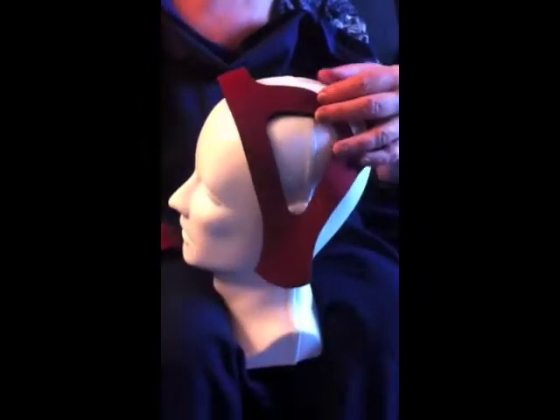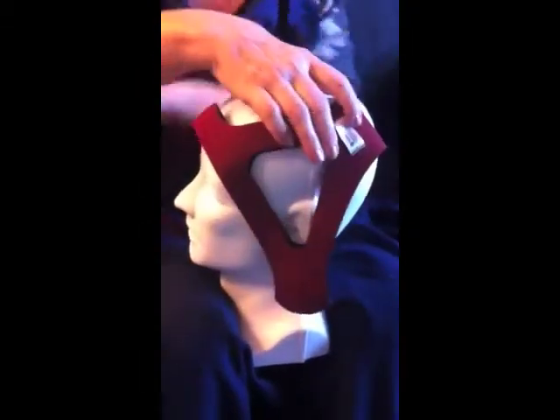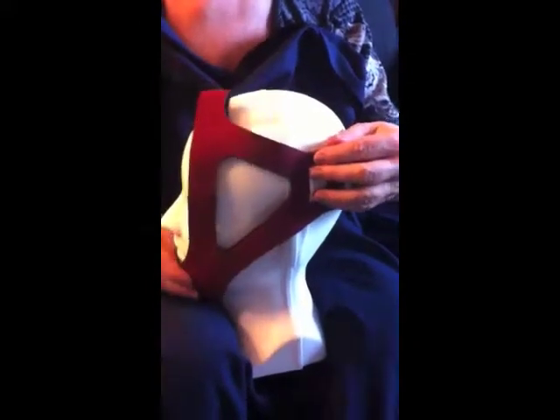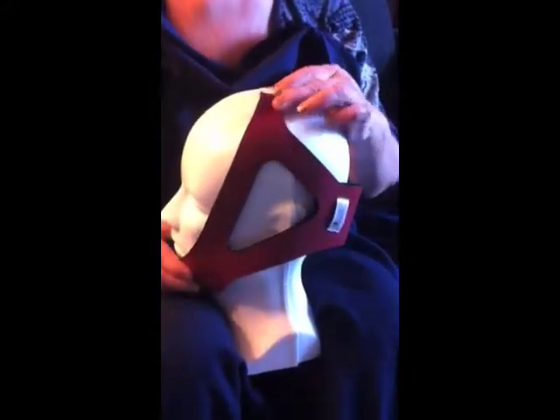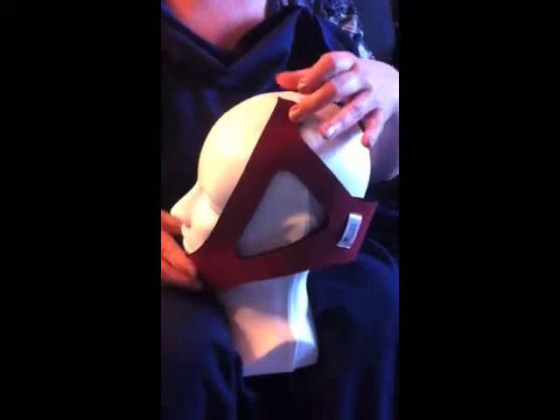It comes in a small, a medium, and a large. For this particular head I would use the large, and how I determine that is I would hold the chin strap here, I would hold the top of the strap here — I want about an inch to an inch and a half of give to it.